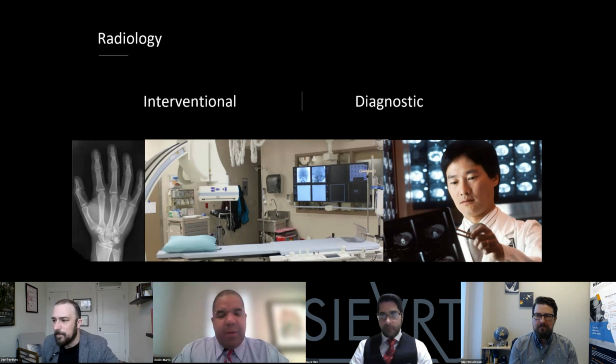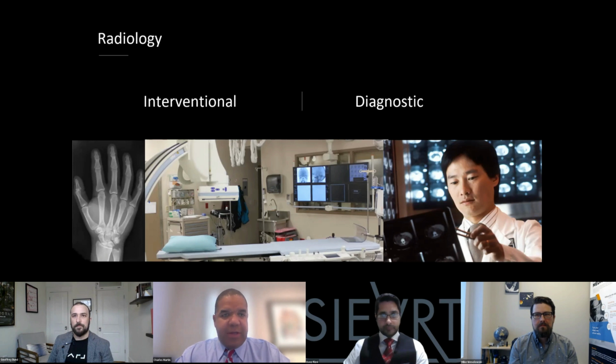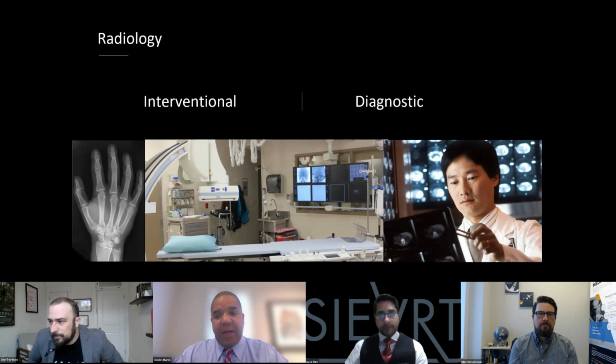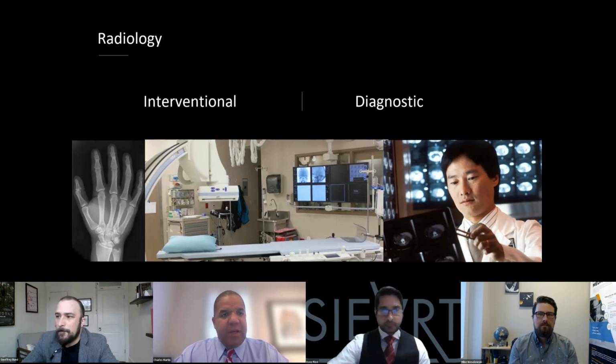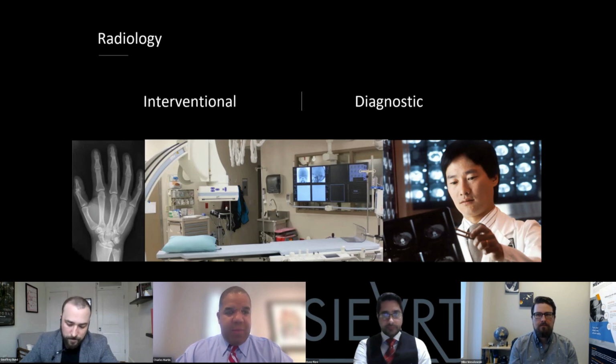Thanks, Aves. Hi, everyone. My name's Chuck Martin. I'm an interventional radiologist at the Cleveland Clinic. What an interventional radiologist does is we are a subspecialty within the field of diagnostic radiology, in that we perform minimally invasive procedures using image guidance, oftentimes catheters and wires, along with different imaging modalities, whether it's ultrasound, CAT scan, MRI, or fluoroscopy, or real-time X-ray, as you see in the middle picture here.